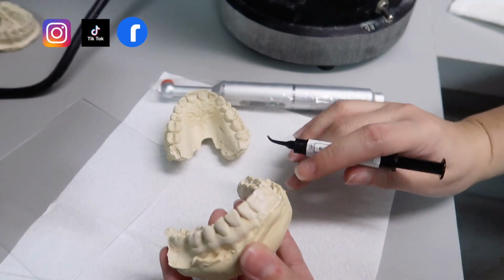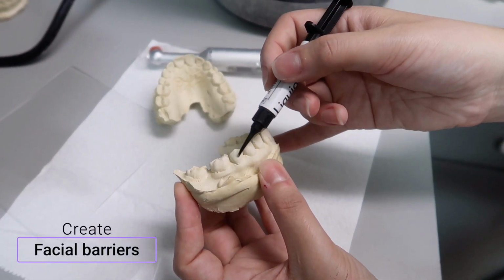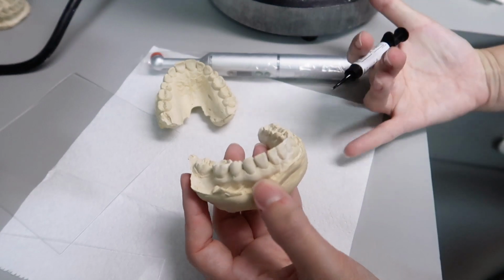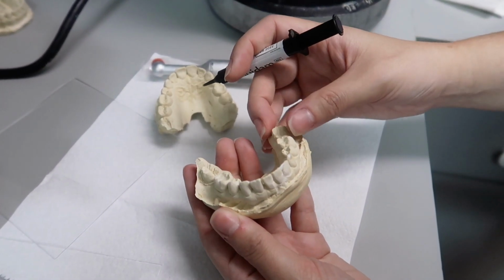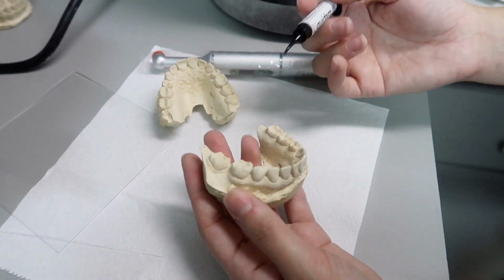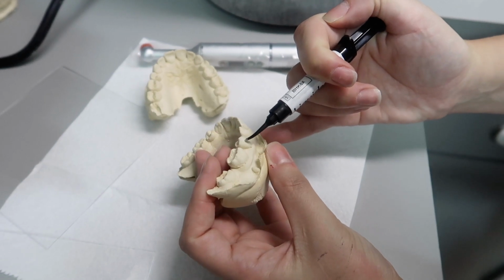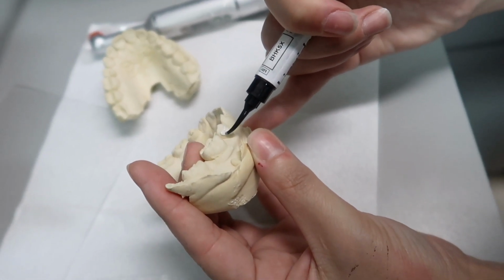So now what I'm going to do is start making what I call room for the gel to sit on your bleaching trays. I know everybody does it differently. Some people don't do this step. I personally like to do it just to make sure that once the patient puts the trays in, the gel is not going to leak to the gums. So I always tell patients, don't worry about the molars. You're always going to bleach just premolar to premolar, because that's what you show. So I'm going to start on my premolar. I agree with this. I know people that don't do it, but I do like it.